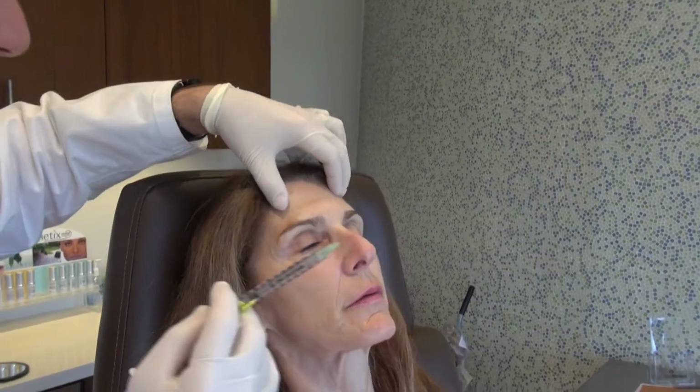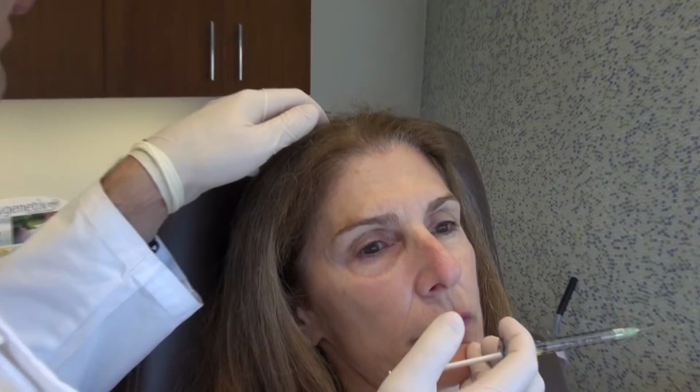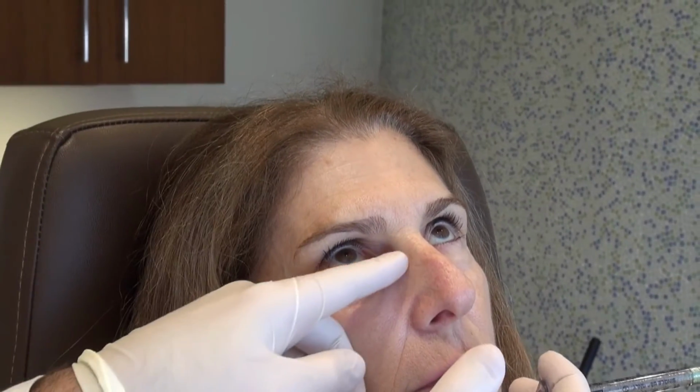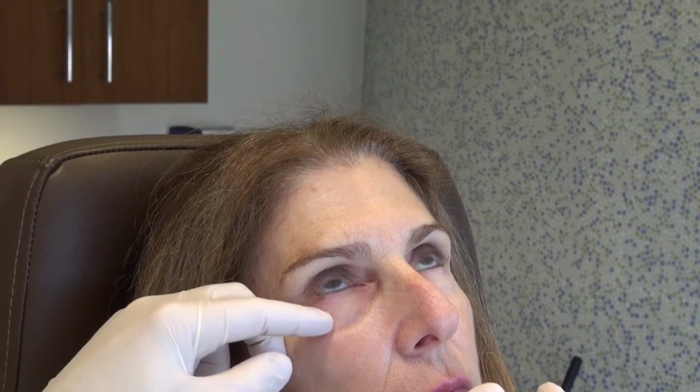Okay. Now, keep your chin down. Look up just with your eyes. As she looks up, she rotates the globe up, and you can really see that tear trough outlined very nicely. So that's a good gauge of where you want to go and how much you want to fill.